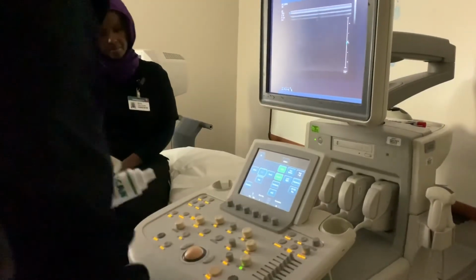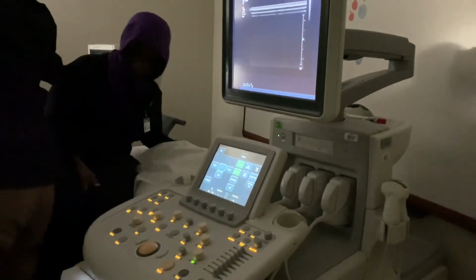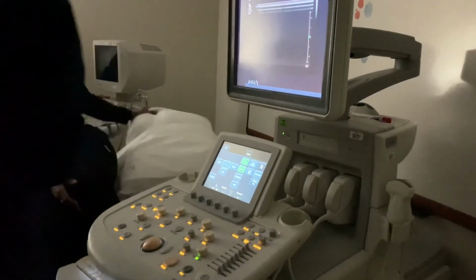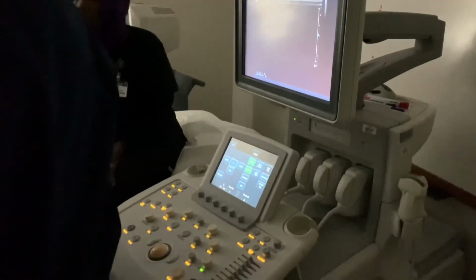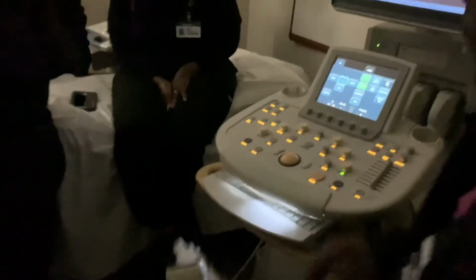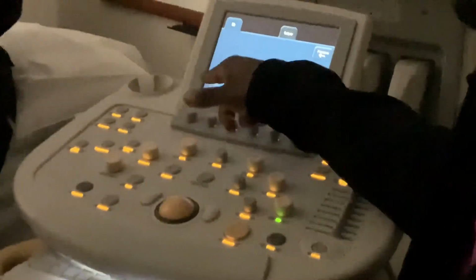So, guys, real quick, on this machine, that far button over, you see that top button right there? That says acoustic power. That's how we're going to change the strength of our signal. On this machine right here, it's called output power. On the IU-22 itself, we're just going to go to the next screen, and you're going to see output power right there. That's how we're changing the actual overall brightness of the image.